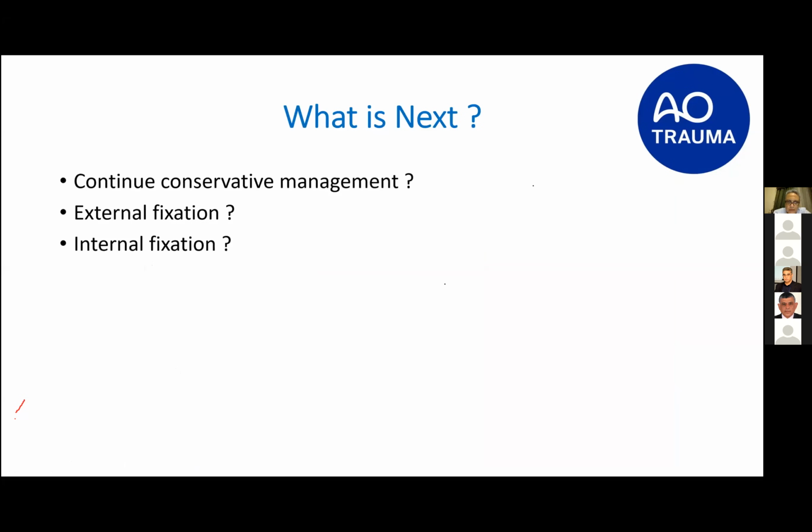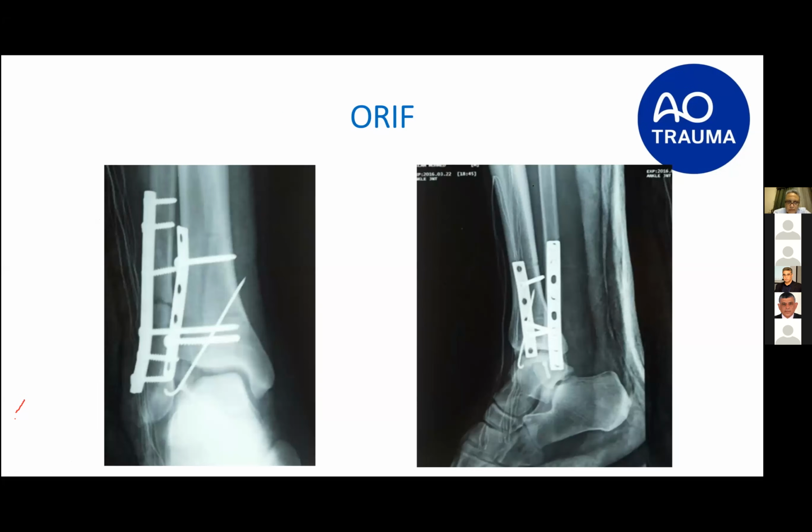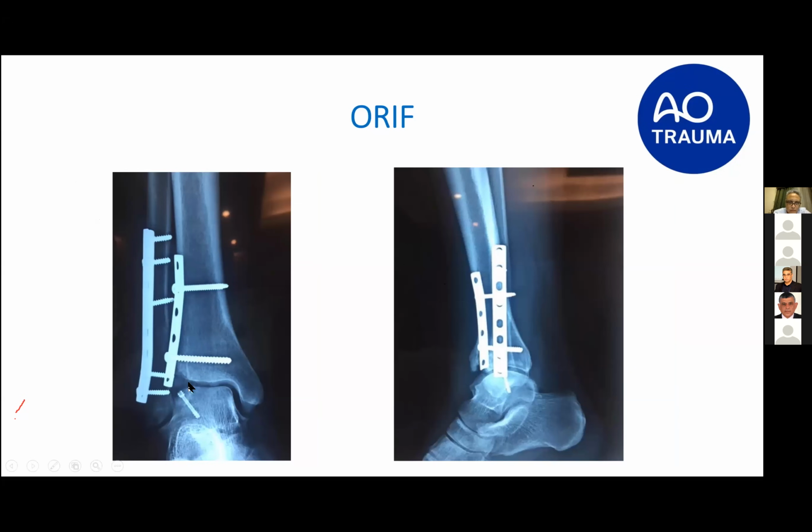Was it absorbed, or have you removed it, or is it not apparent in the X-ray? I don't understand. Right here in this X-ray, where the fragment was, this corner is empty.